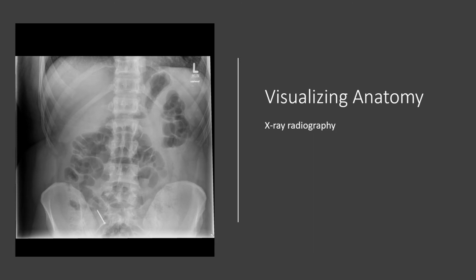Okay, and here's another X-ray. I'm just going to point out what's wrong with this picture. Here's your vertebrae, that's your spine, yay! Here's your hips, here's your ribs, all through here. All this black stuff in here, this is actually your intestines, empty intestines.